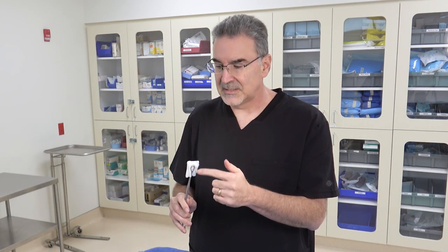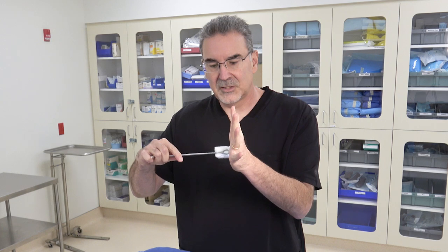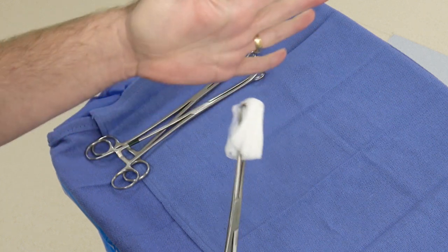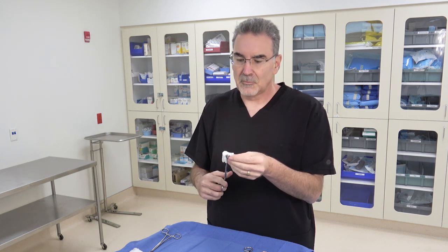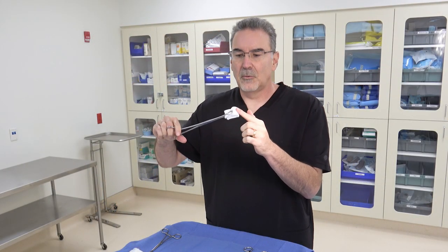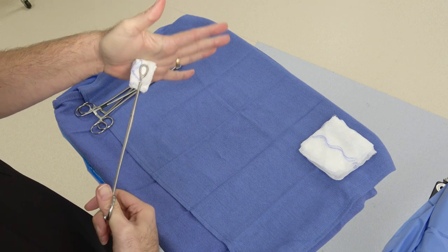Notice how the sponge is positioned in the clamp — about a centimeter of the sponge sticking out above the tips. That way the metal is not pressing against the tissue, but the sponge isn't too floppy either. Don't load it so close that the metal tips are touching the tissue, since the whole idea is to have something soft. But also don't load it so far back that the RayTac flops against the tissue. About a centimeter is a good load.